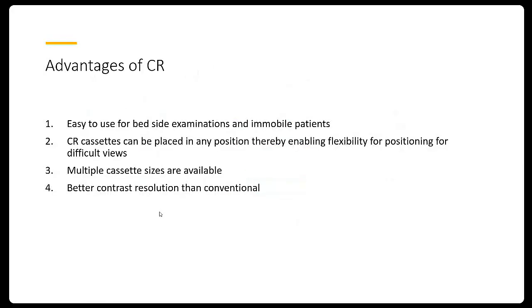Now what are the advantages of CR? So comparing to the conventional film screen system, what are the advantages of a CR system? It is easy to use for bedside examination and immobile patients. Right. So we can do the bedside examinations with the help of a bedside CR machine.